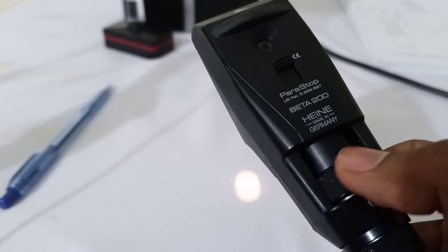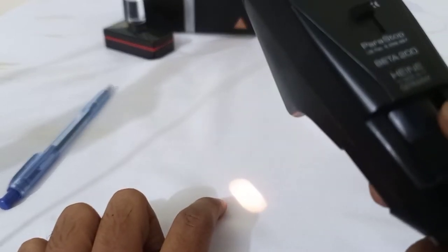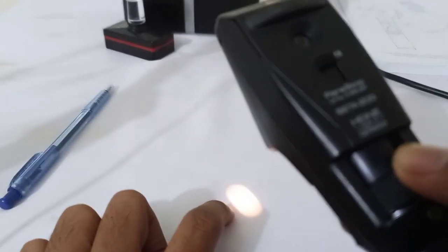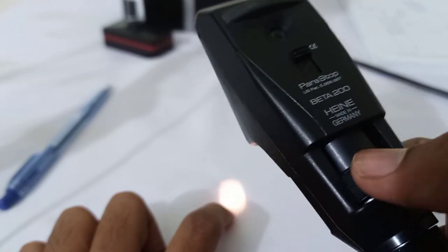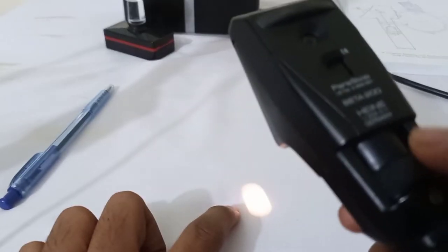By moving and rotating this sleeve, you can see the light spot. This light spot is called the streak of the retinoscope. Because it produces a streak, these modern retinoscopes are called streak retinoscopes. When I rotate the sleeve, the streak on my table rotates accordingly, as you can see.